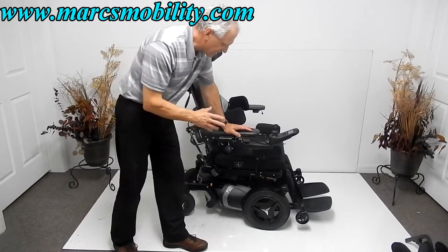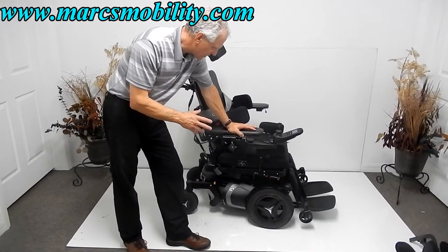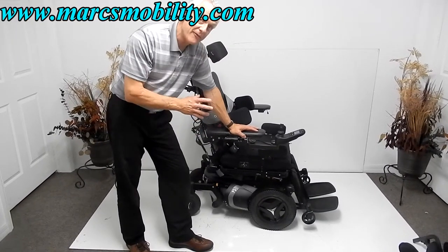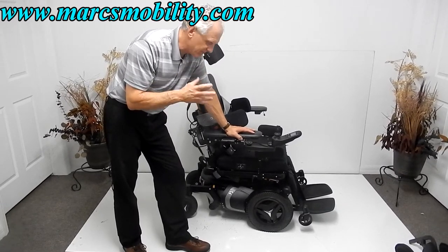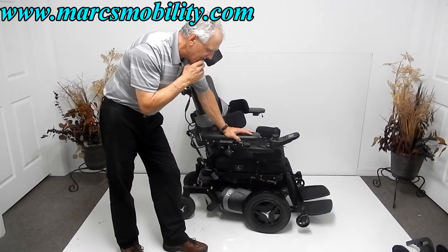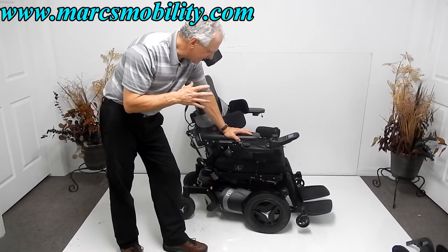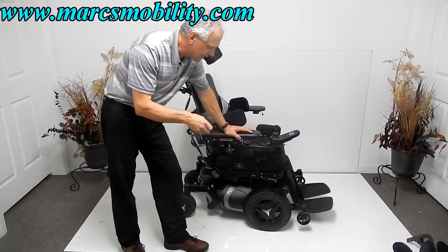This power chair is a 2016 model that was driven for about a year and a half. It has 367 miles, which is about right for that usage. It's in excellent condition and everything works as it should. It's fully loaded.